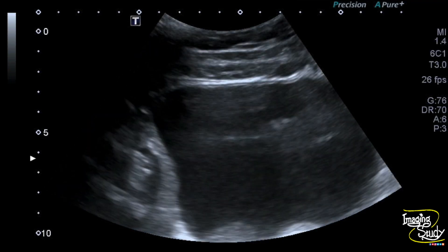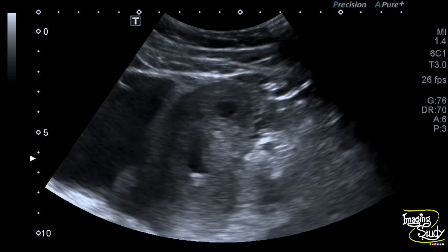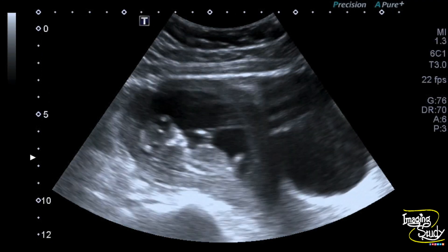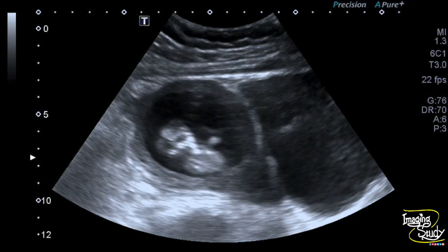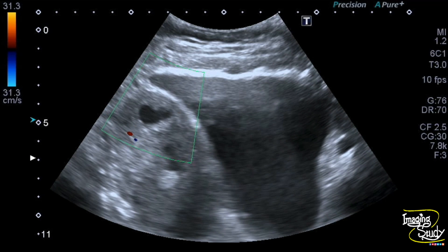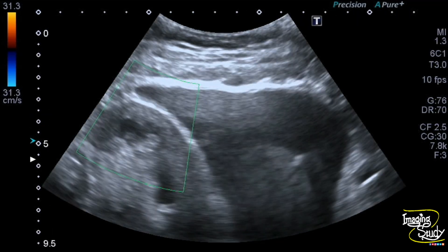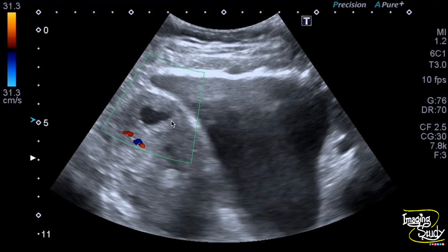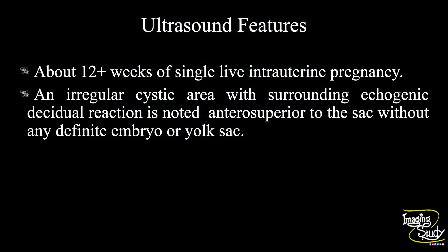The urinary bladder was filled and the overall surrounding region looks normal. The remaining fetus looks normal. In summary, a 12-plus week sized single live intrauterine pregnancy is noted. An irregular cystic area with surrounding echogenic decidual reaction — indicating a distorted demised sac — is noted and is superior to the regular gestational sac, without any definite embryo or yolk sac inside.